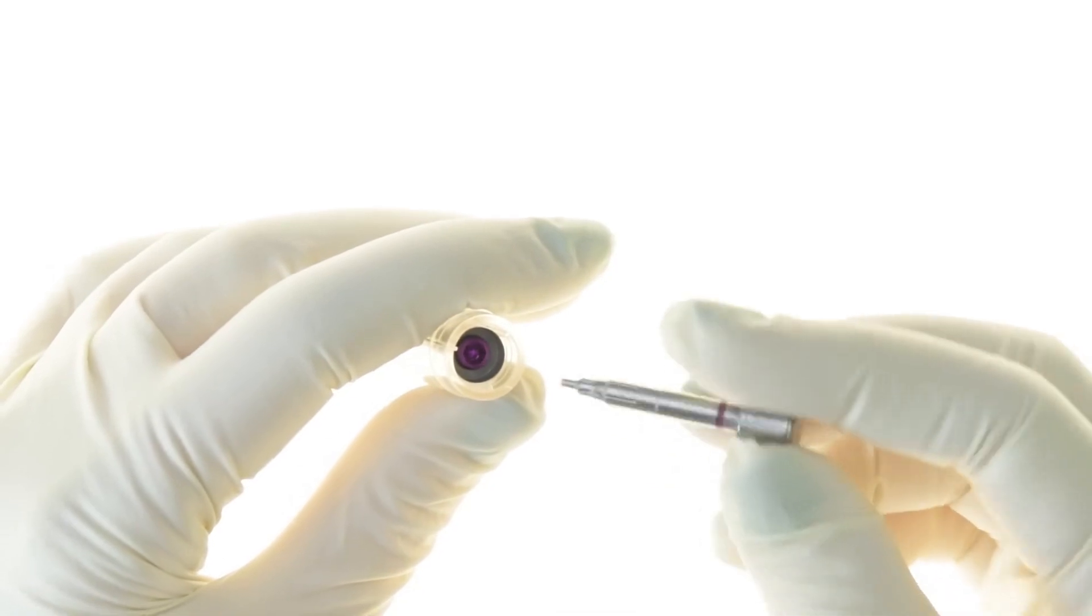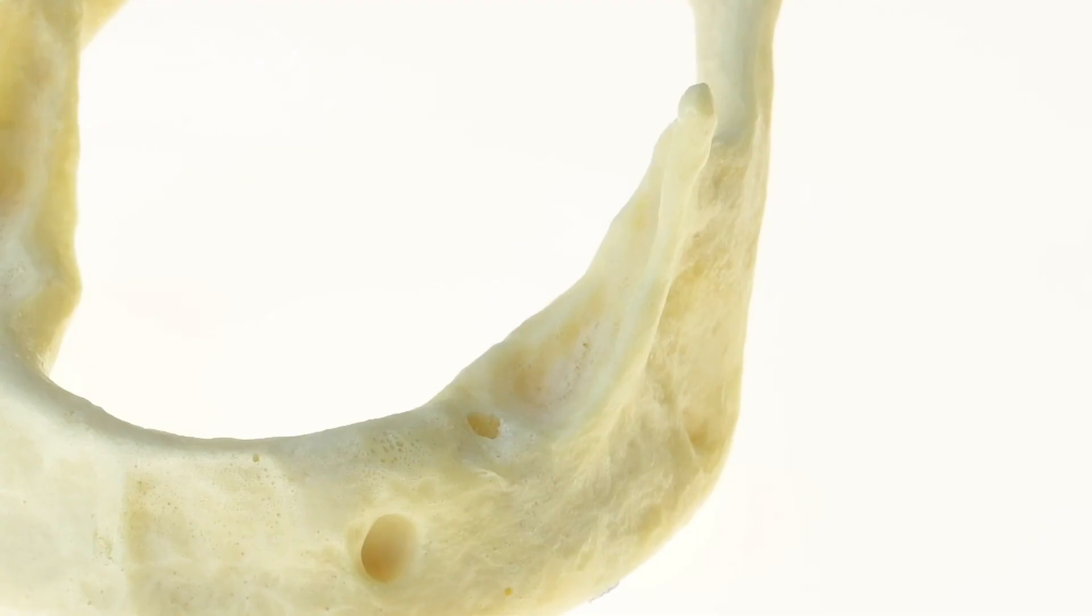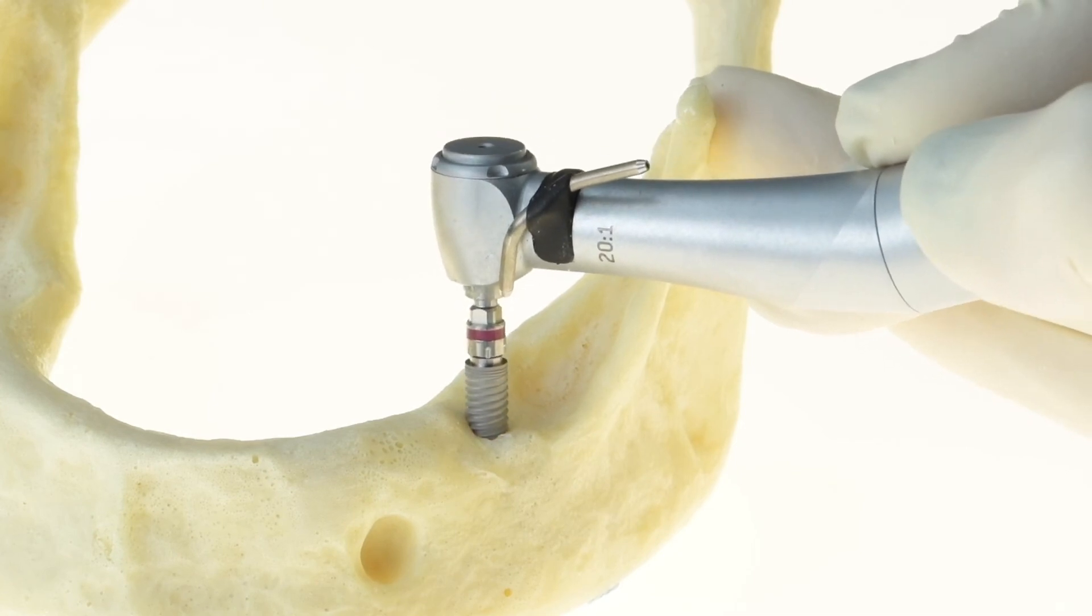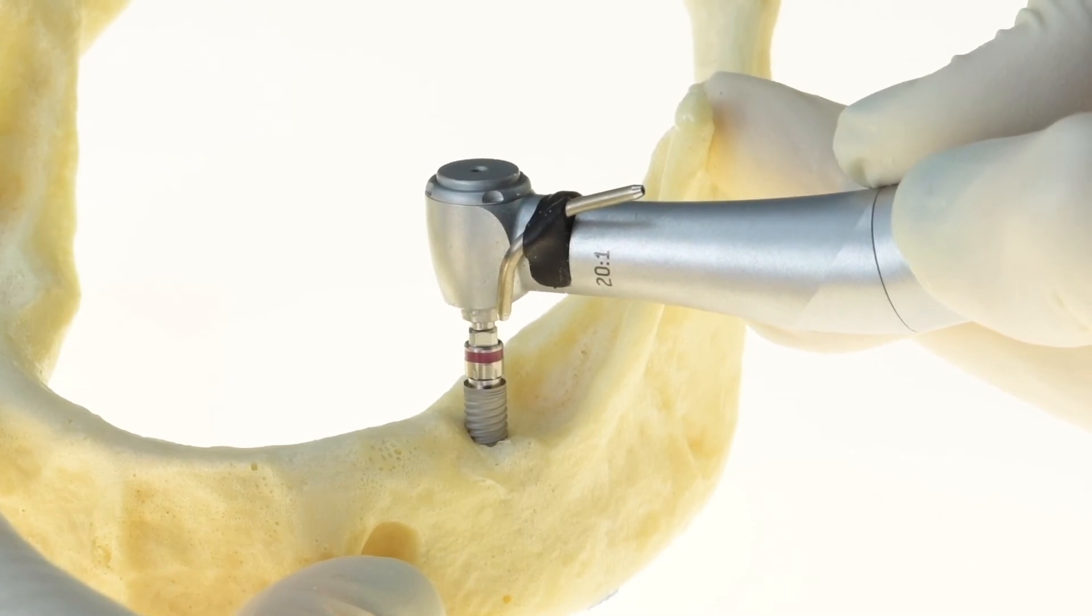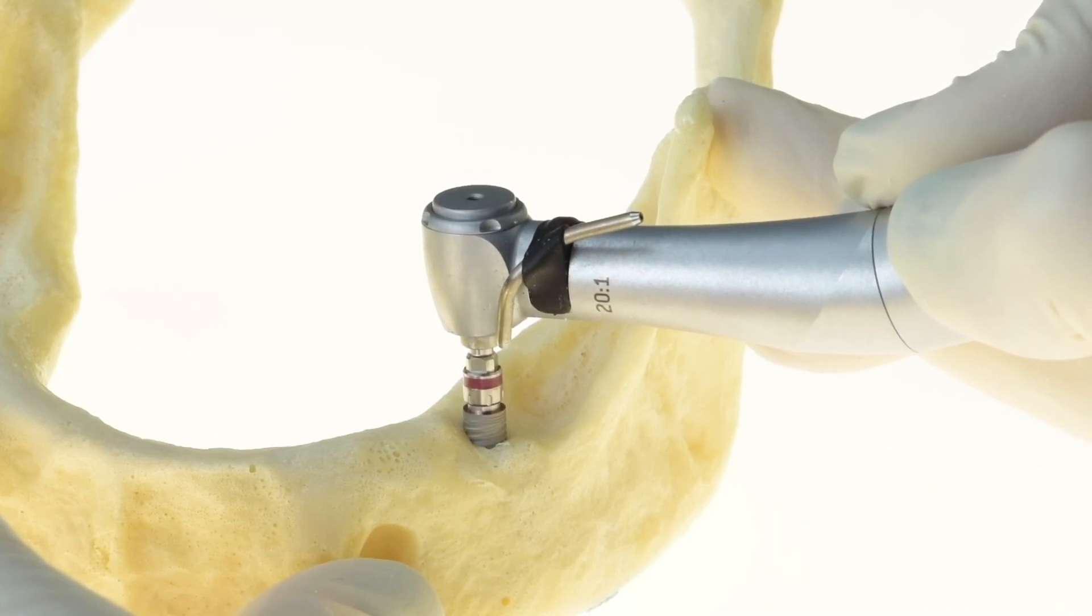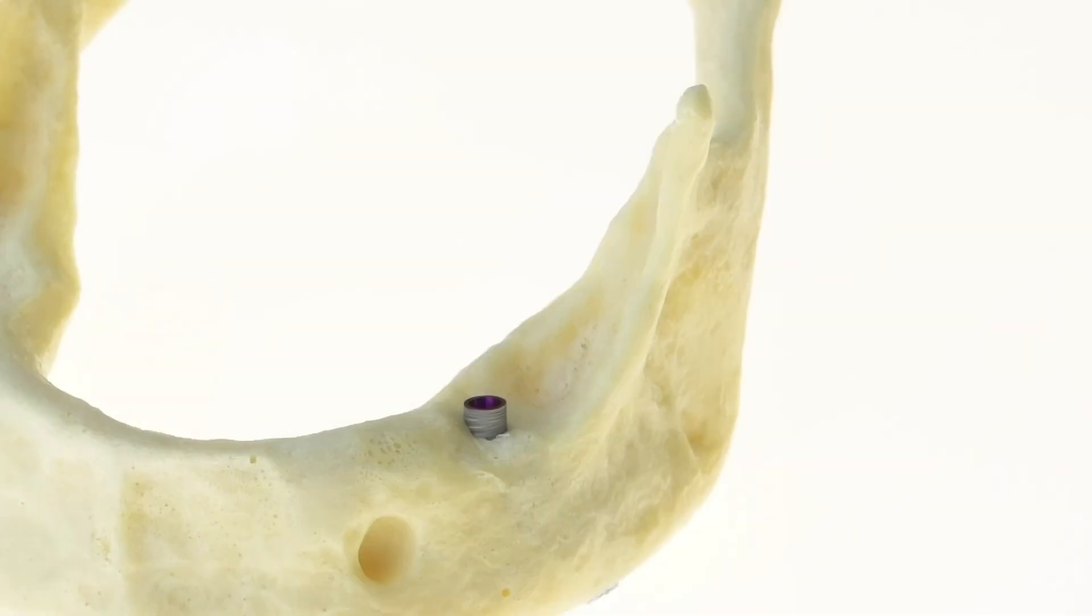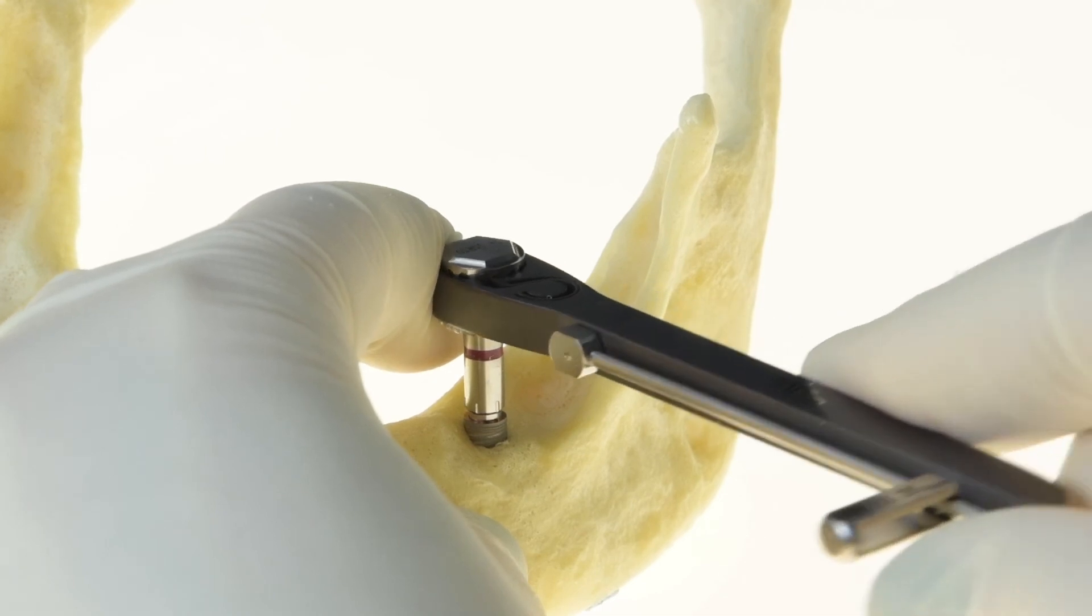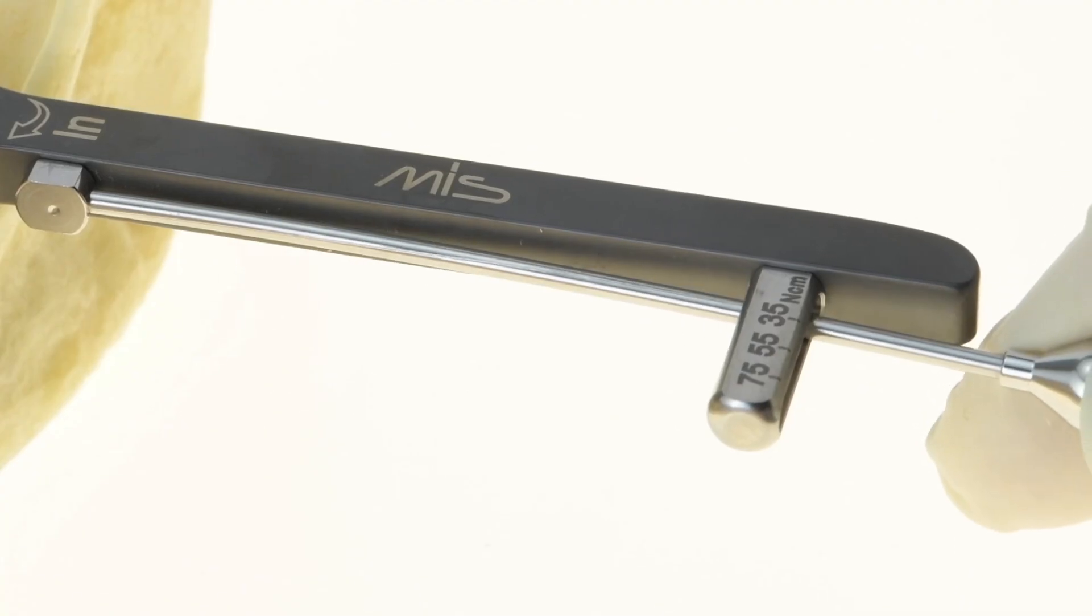Use the insertion tool to remove the implant from the sterile packaging. To complete the placement, we use a torque wrench. The recommended torque for MIS implants is 35 to 60 ncm.